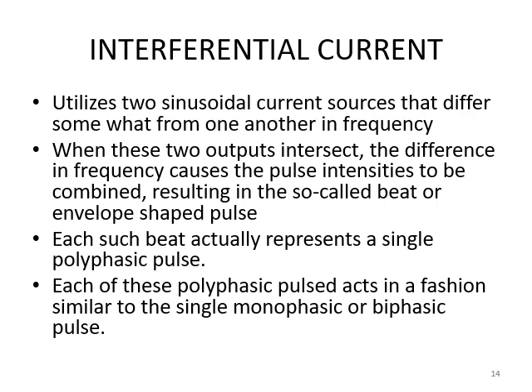Sometimes the peaks merge and have an addition effect. Sometimes the peaks and troughs match and have a cancellation effect, and the system is made in such a nice way that whenever this interference occurs between these two currents, they produce a typical envelope shaped waveform with progressively increasing and decreasing intensity.